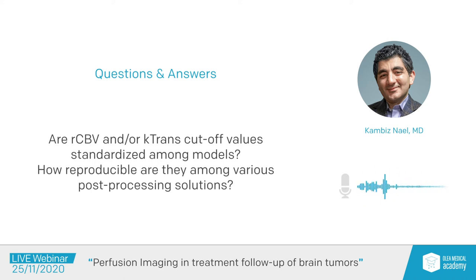Yeah, that's a very good question, and I think that's really where the challenge is. If you look at the literature, again, for use of DSC, for example, and CBV specifically, to differentiate the two, there is a different variety of thresholds between institutions and between different software. So I don't think they're standardized. This is, again, what we use in our practice.